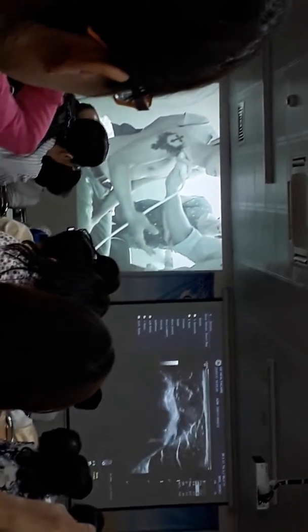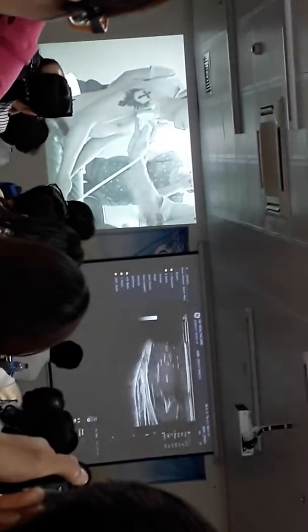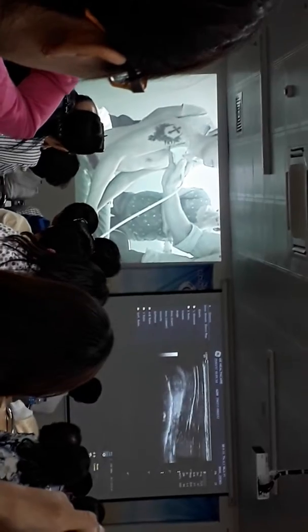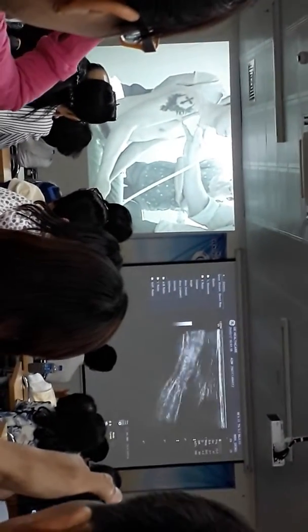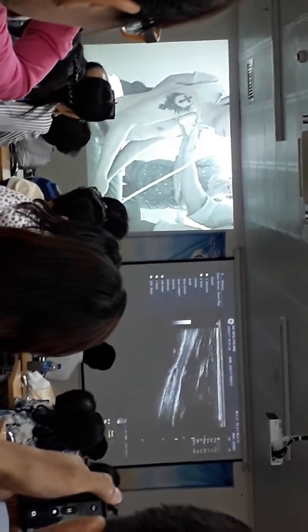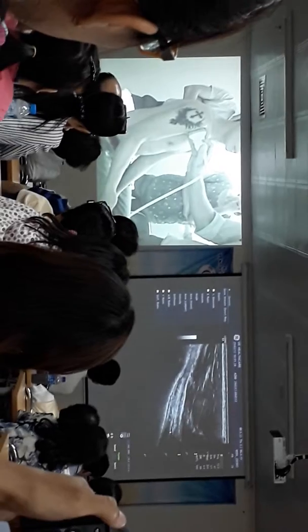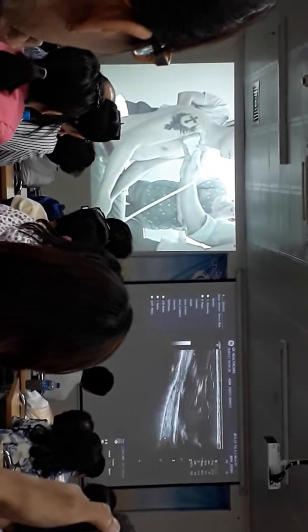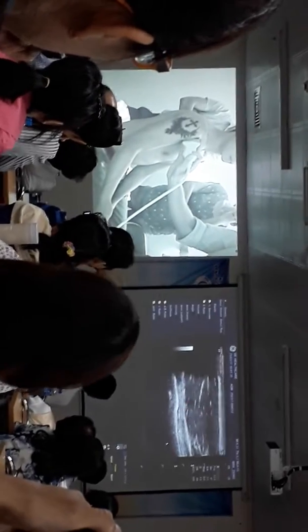Okay, so from there I would have a look at the tendon in longitudinal plane. Mình xoay đầu dò dọc để khảo sát trục dọc của gân nhị đầu. So to get this image, if you just put the probe straight on the skin, you can see that the tendon dives deeply. Mình xoay đầu dò dọc thì mình sẽ thấy là cái hướng đi từ phía đầu về phía chân, thì cái gân cơ nhị đầu sẽ đi từ nông về sâu hơn.